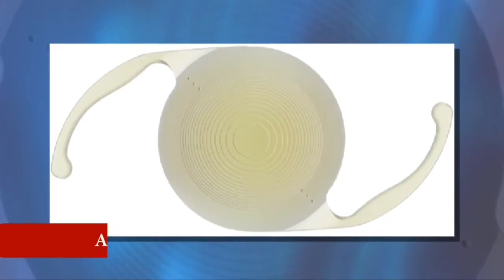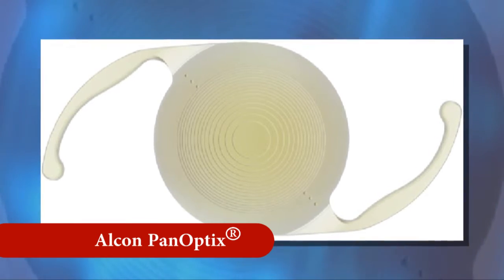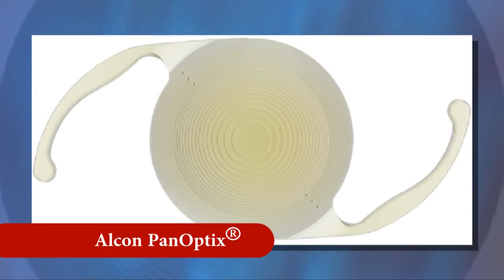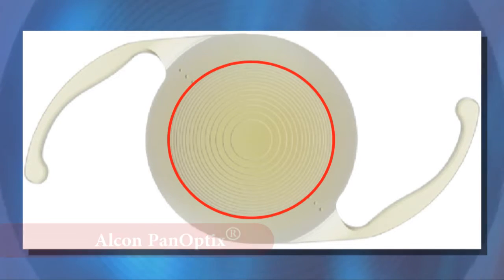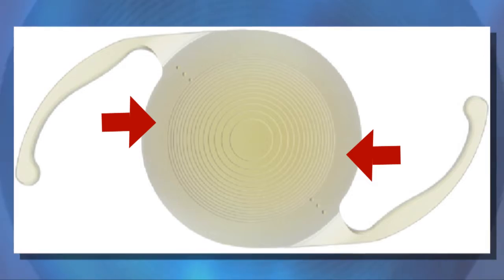This IOL has all the features of the classical IQ family, with an optical zone composed of a diffractive structure in the central 4.5 mm portion, consisting of 15 diffractive zones and an outer refractive annulus.